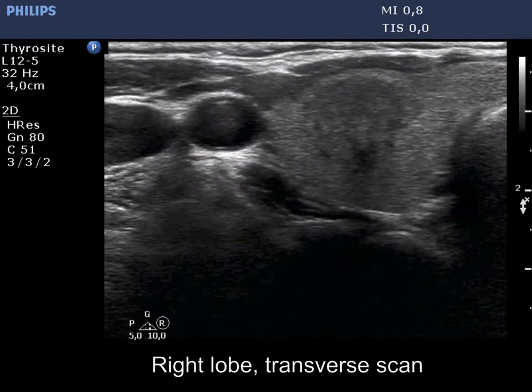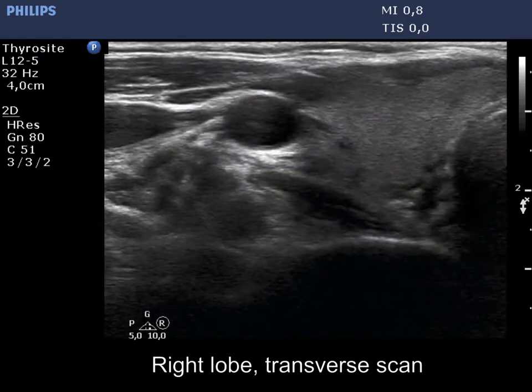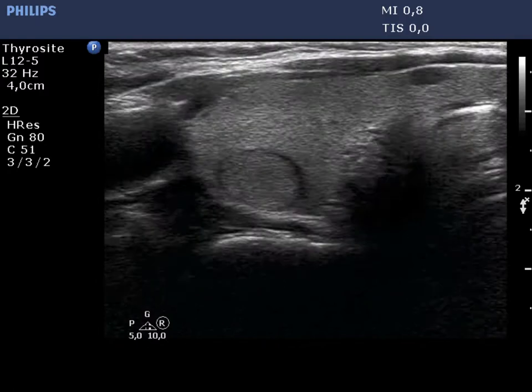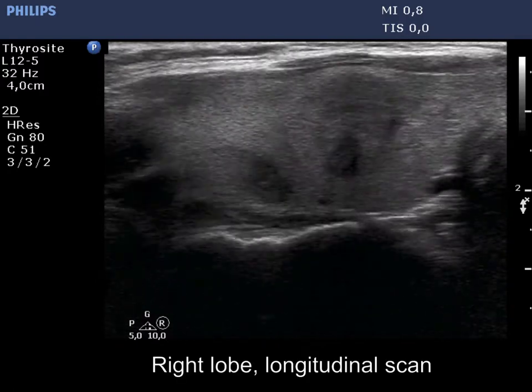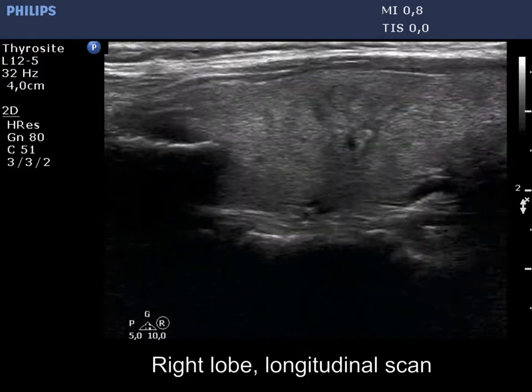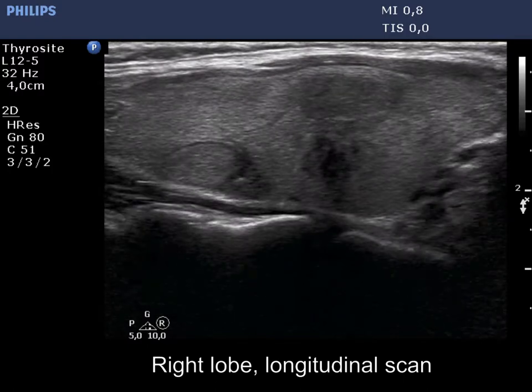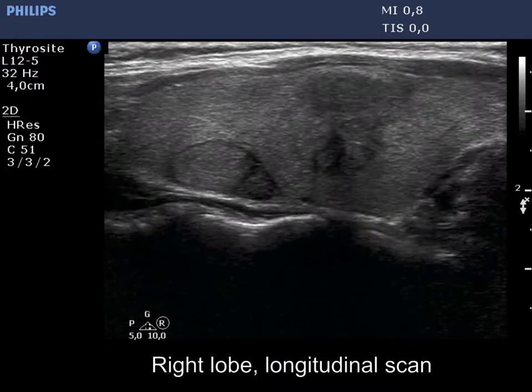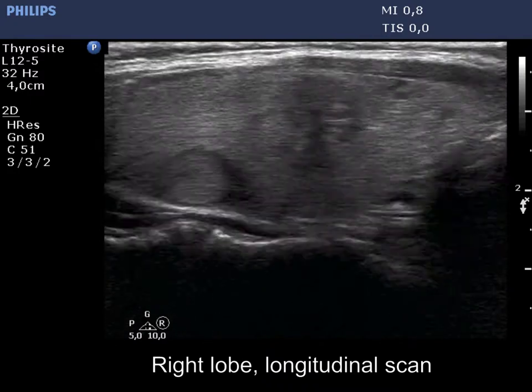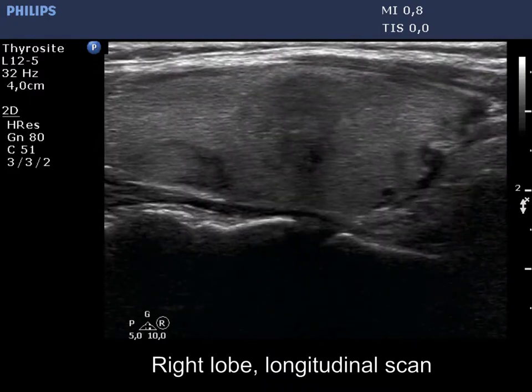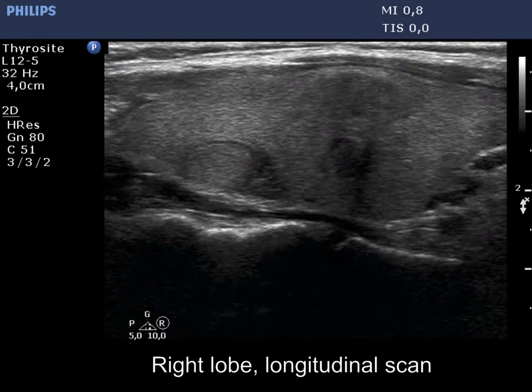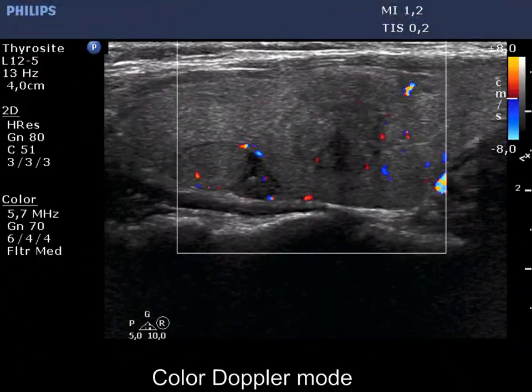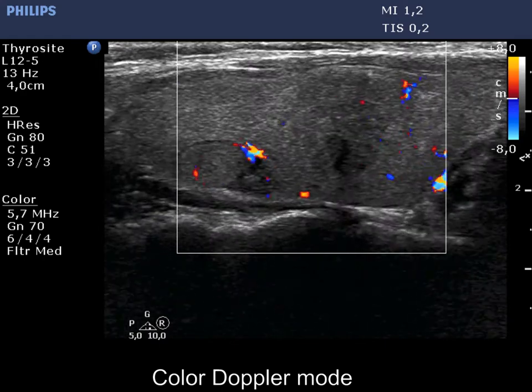The right lobe has three distinct lesions. The largest one is the most interesting. This is moderately hypoechoic, has partly blurred, partly lobulated margins. It resembles de Quervain's thyroiditis. The vascularity is not specific.